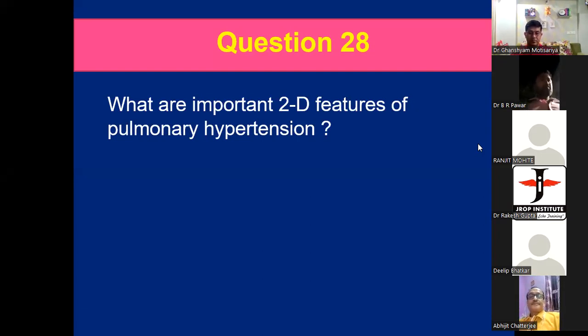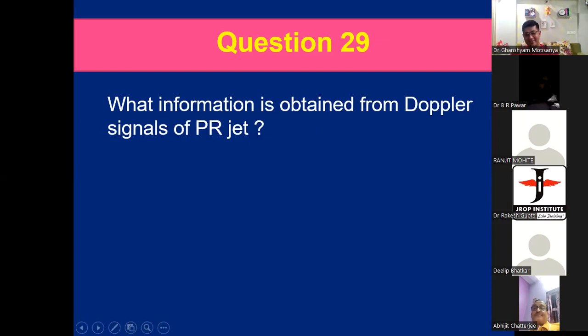And in case of pulmonary embolism, we can also get a McConnell sign. Yes, we can get that also. All right. Now you have become more intelligent than me. No, sir, I am just starting, doing my pharma.